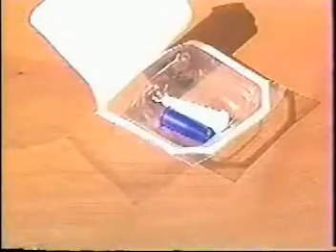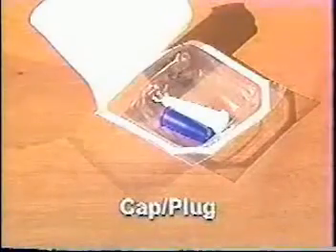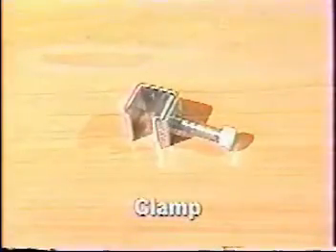In order to apply the leg bag, you will need some equipment. You will have to have a sterile drainage cap and plug, and it will come in a sterile package. You will need to use a clamp to clamp the catheter to stop the urine from draining. And you will also need an alcohol wipe to wipe off the bag's top.